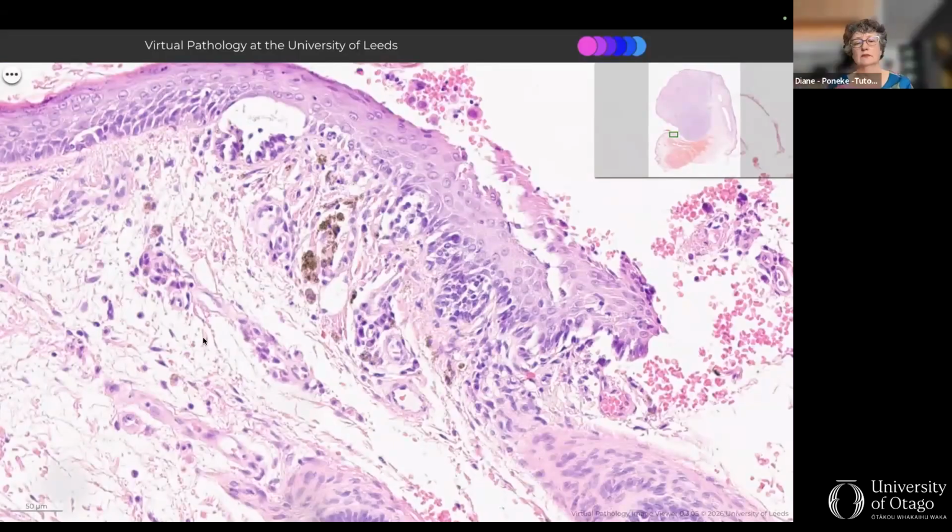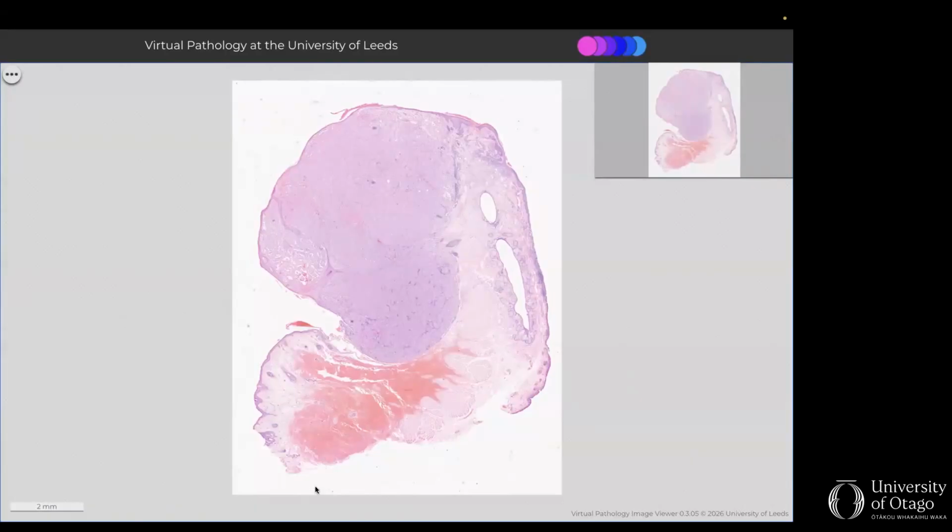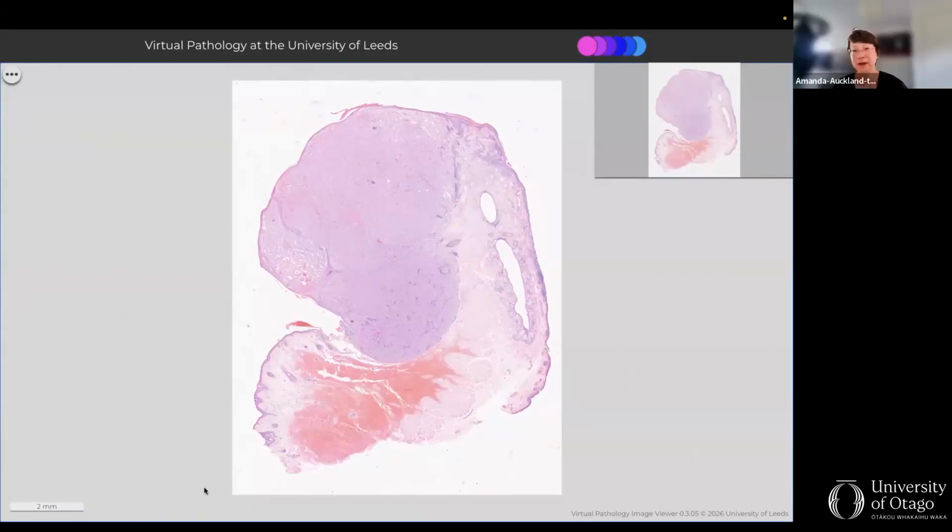Great. Yeah, and I think it's completely excised. It's clear of the margin. It's got a vertical growth phase, and I could measure it even. See, there's a little millimeter scale down in the bottom left corner. It's about 5-6 millimeters in depth. Yeah, huge. It's very deep.